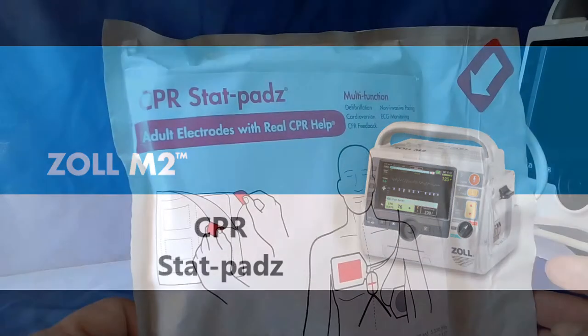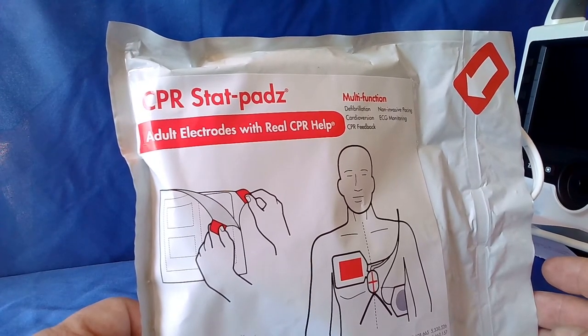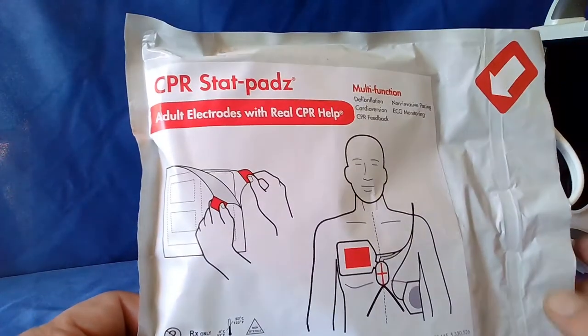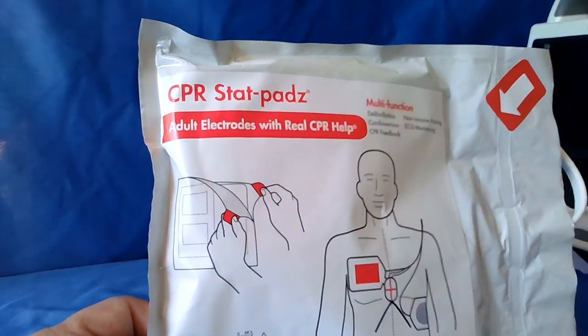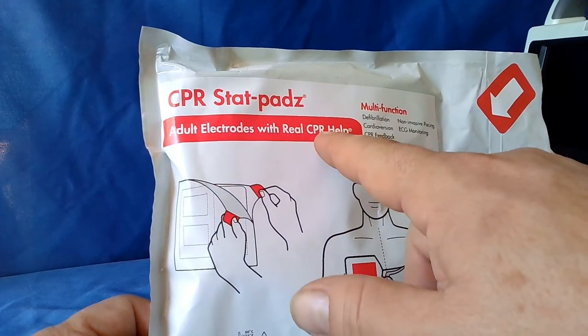Along with your Zoll M2 defibrillator, you would have received a set of electrodes. It would look something like this. It's a CPR Statpadz. These are adult electrodes with real CPR help.